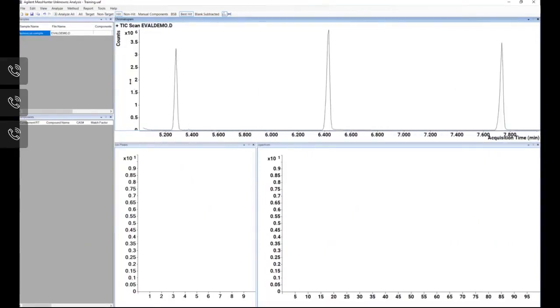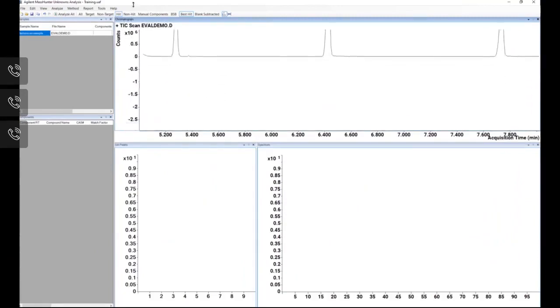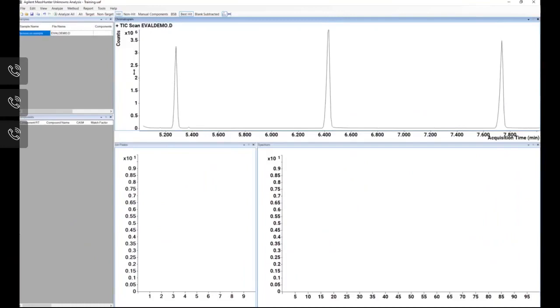Go ahead and do the same thing in the y-axis. Left click and hold sets the y-axis and holds it, or I can get my double arrows, right click and hold, and expand or shorten my y-axis. So it makes it very nice.